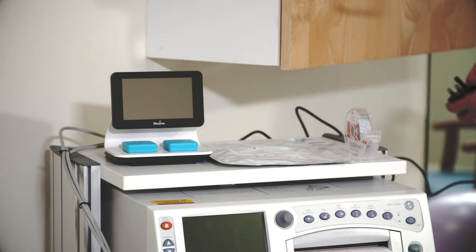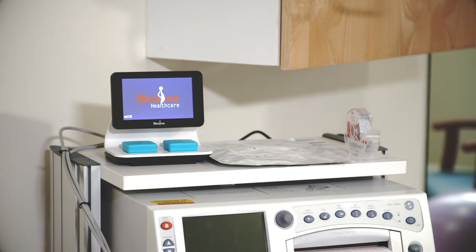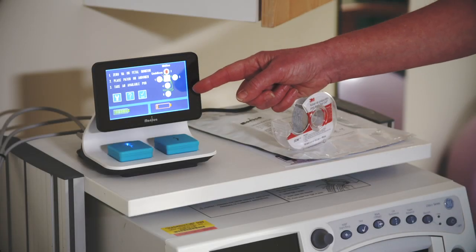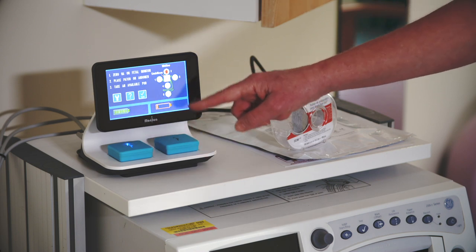Now connect Novi to the AC power outlet. The Novi does not have an on-off switch, so after a few seconds you will see the Novi start screen. Looking at the start screen, above each of the pods in the charging bays is a battery icon showing the battery status of the pod below.